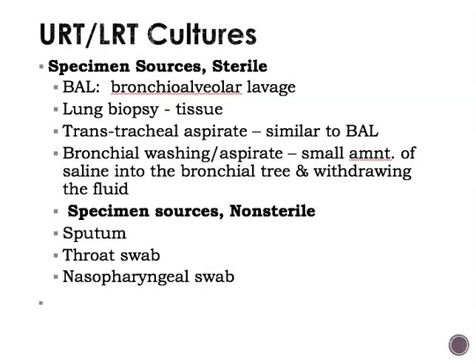A throat swab. This is what would be collected if the doctor suspected group A strep. So just a sterile swab that is used to swab the back of the mouth. And then a nasopharyngeal swab. Those are the type that are used for flu and COVID testing, where they stick it in your nose.